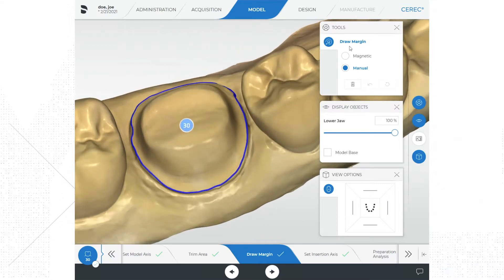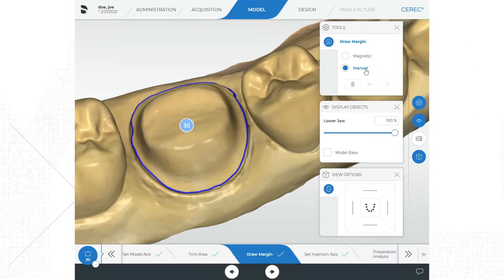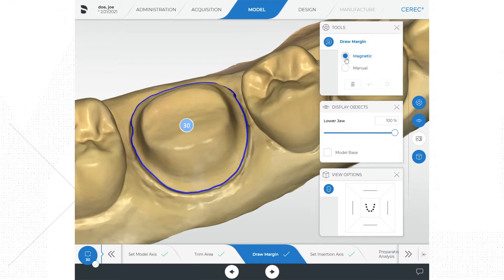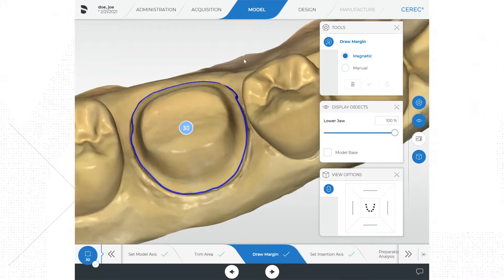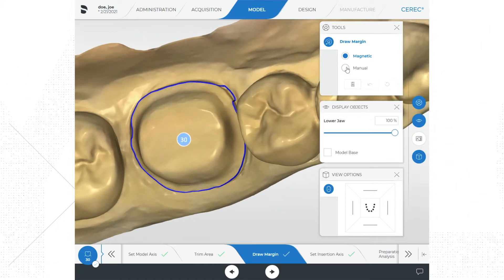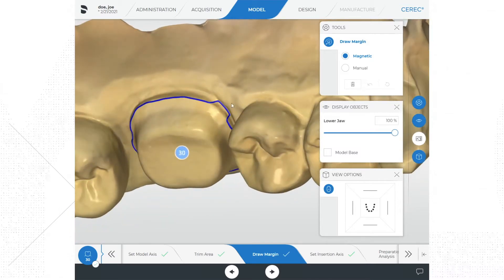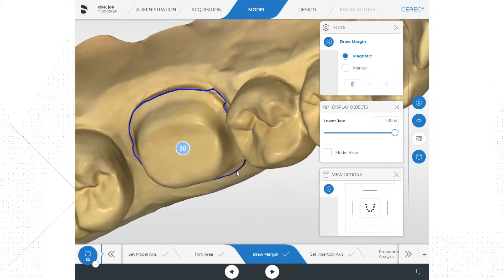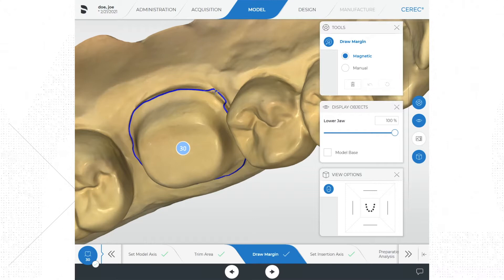On the right side of the screen you will see a menu that says tools. Within this menu you have two options for drawing the margin: auto, which is listed as magnetic, and a manual option. The system defaults to auto and that is the option I choose 100% of the time. However, you can turn this off in the system parameters if you prefer to always manually draw your margins. Since the margin is already drawn with this version of the software, I'm going to check it and see if there are any adjustments that need to be made. In this case we do need to make some adjustments.